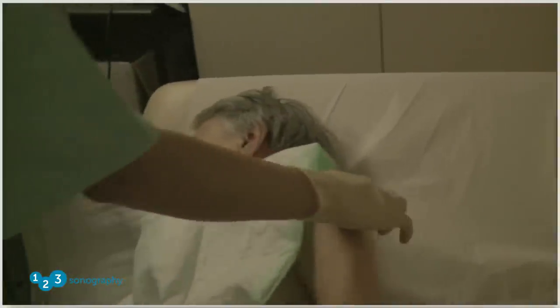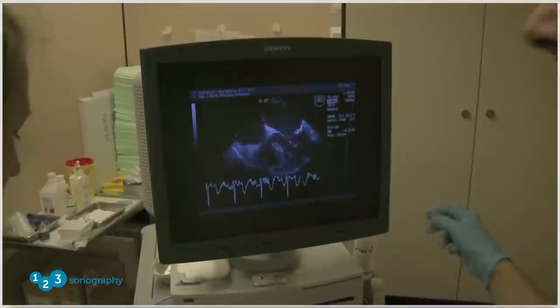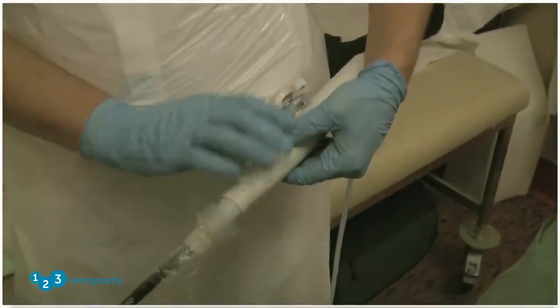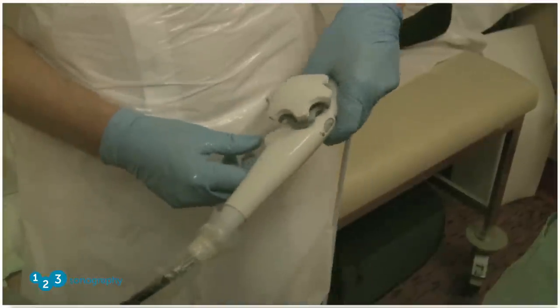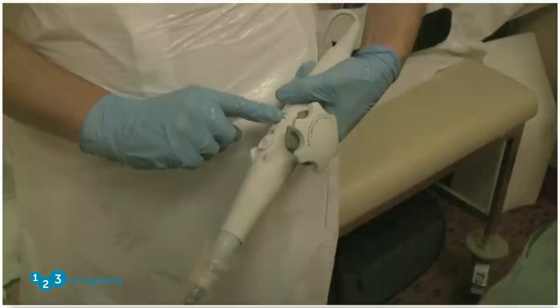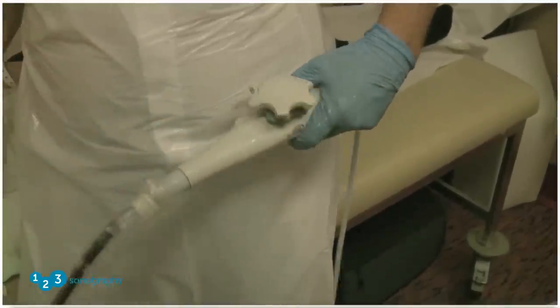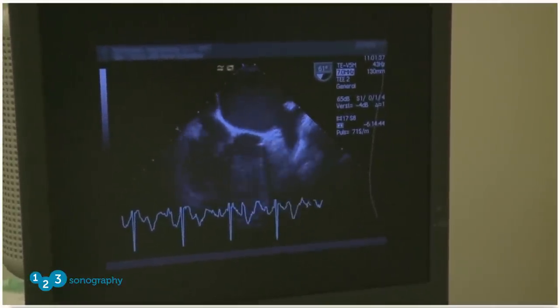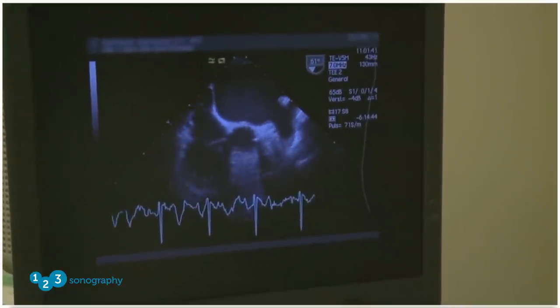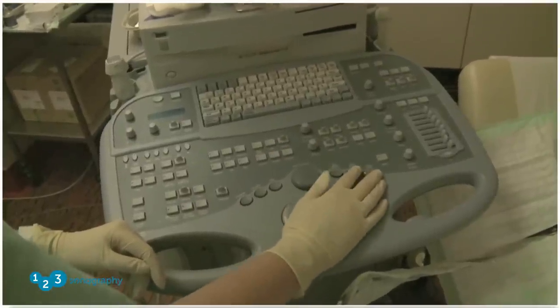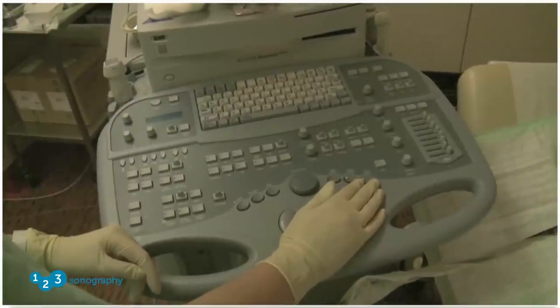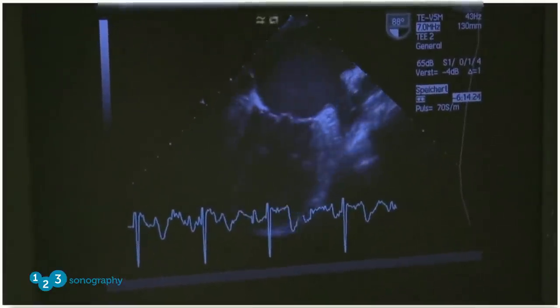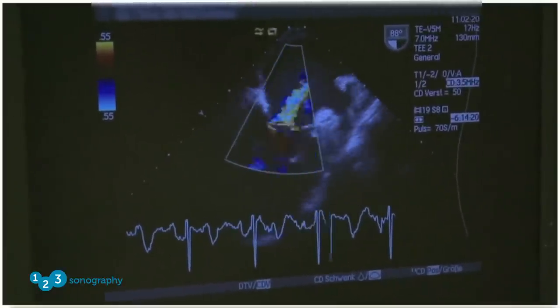Then we simply perform the procedure. We start with a four-chamber view looking at the structures we need to see. We use the wheels to adjust the tip of the probe in both anteroflexion or retroflexion and lateral and posterior directions. We also use buttons to change the angle of the transducer on the tip of the probe, then rotate and turn the probe to see the necessary structures — in this case the left atrial appendage. Usually we have a second operator to press buttons on the machine, which is more hygienic.